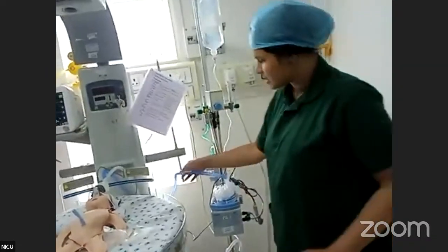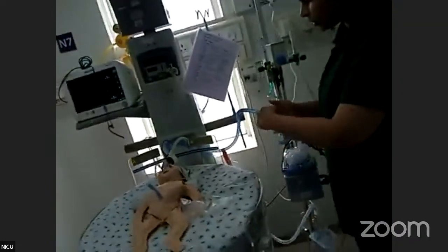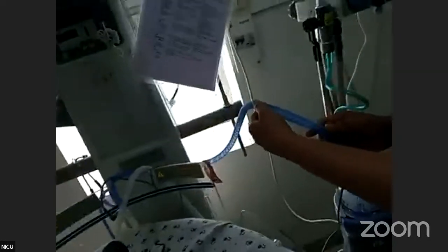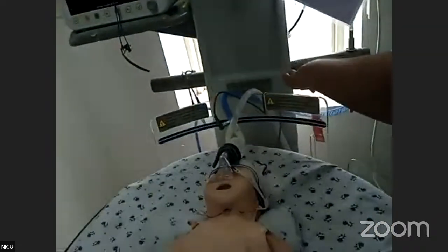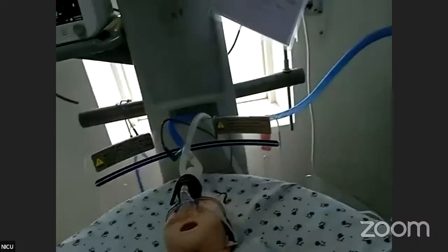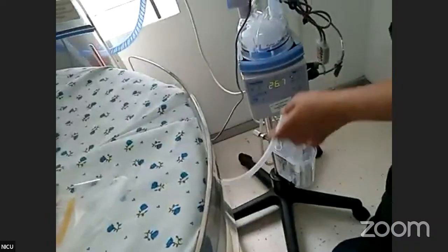Now, a heater wire is placed all through the inspiratory tubing in order to heat. Ongoing heating of gases is facilitated because of the heater wire. It is present until this last segment where there is some drop in temperature that will happen. So until this segment, there is ongoing heating and this prevents condensation. There is no heater wire in the expiratory limb, hence condensation is a norm in the expiratory limb.